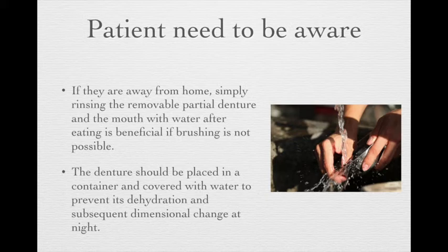You have to remind them that this rinse is just like cleaning a dish. You don't want to use the dish over the past meal, so you definitely don't want to use the RPD over a meal. So patients always need to be reminded that, no matter what, they should clean the RPD and the teeth after the meal.